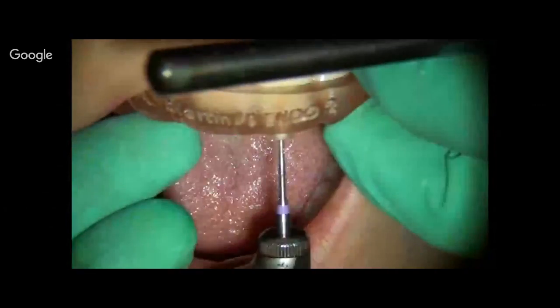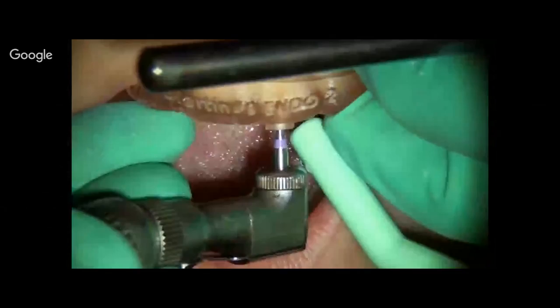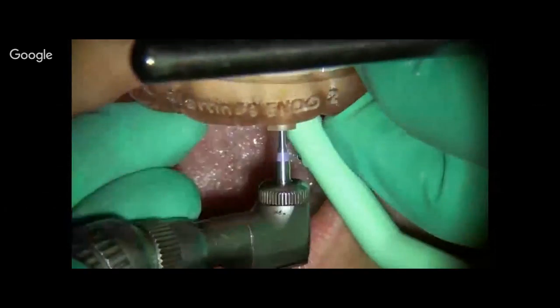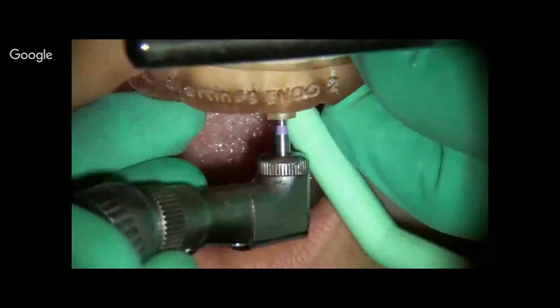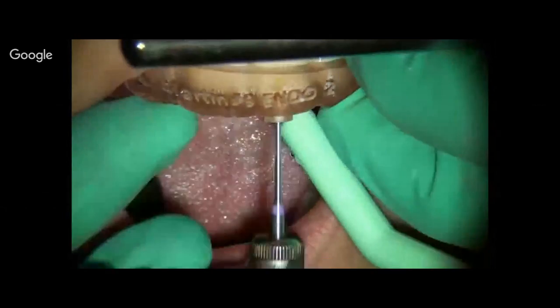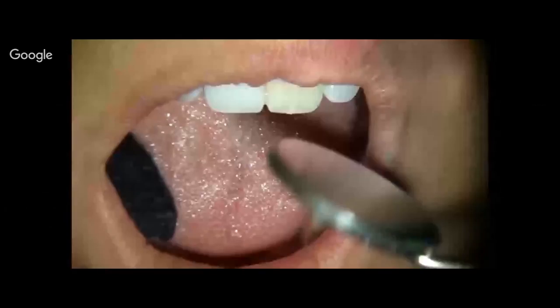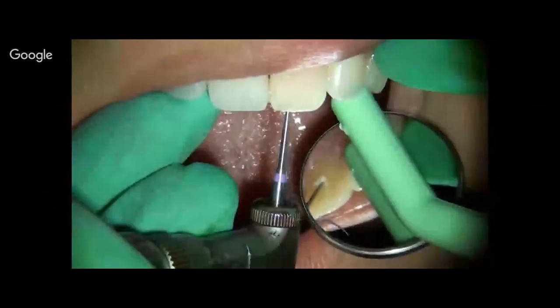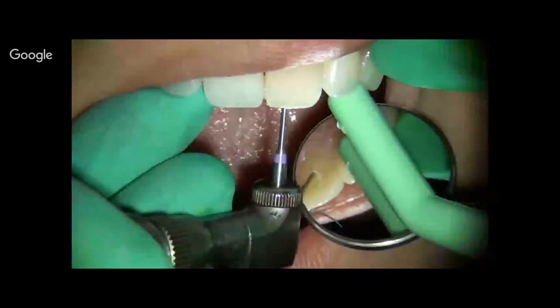Unfortunately, you cannot do this with the rubber dam placed on top, and that's why you have to drill through it like this without the guide so you can fit the guide properly. Now I'm using the second guide, and that would allow me to go deeper with the longer drills and gain at least another 2-3 millimeters deeper.